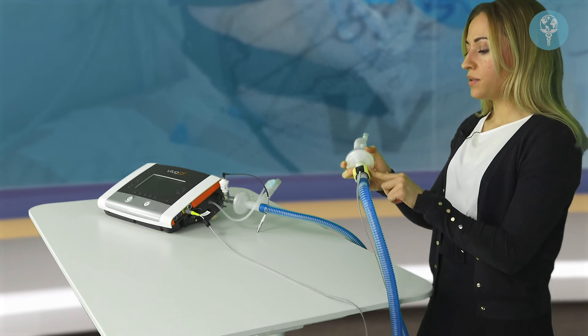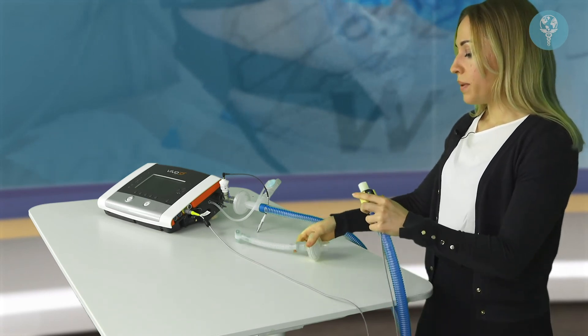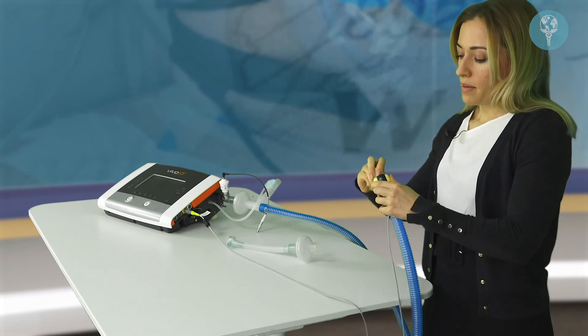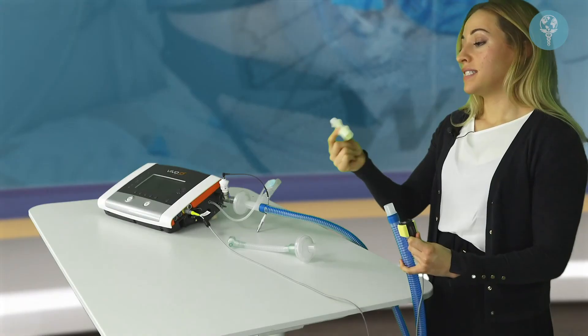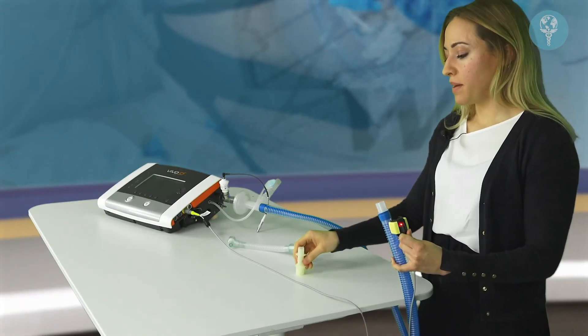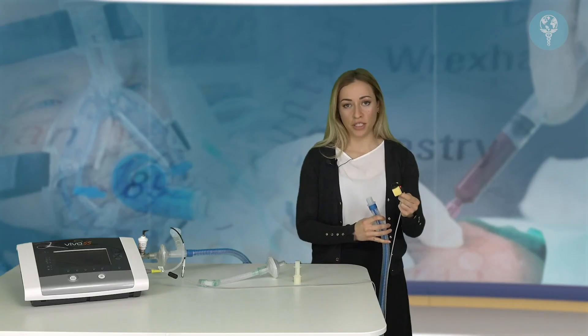Another important point regarding the end tidal CO2 sensor is that it comes in two parts. One part is disposable and the other is not. The airway adapter is single patient use and should be changed between patients. The sensor itself is not single patient use and should just be cleaned between patients.